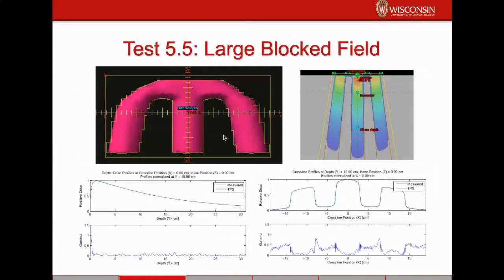One thing I wanted to do is go through a subset of the tests in Medical Physics Practice Guideline 5A, just to give you a sense of what's in there. I didn't want to go through all of the tests because there are like 20 or so, and that probably would have occupied the entirety of this presentation.